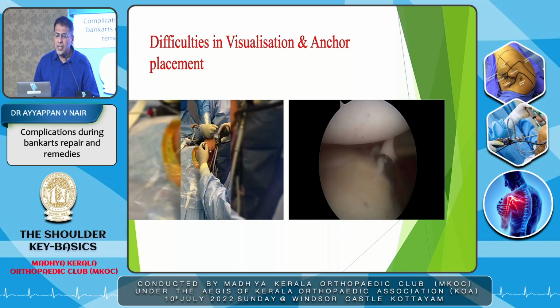but even that is not required. You can manage without it. So you don't have to use a lot of force to distract the shoulder. I'll just show you the maneuver there. You don't have to distract the shoulder too much. You just push it slightly posteriorly and give a small traction. Even your assistant can do it. So it's not a big problem.